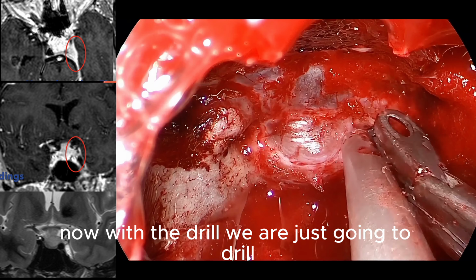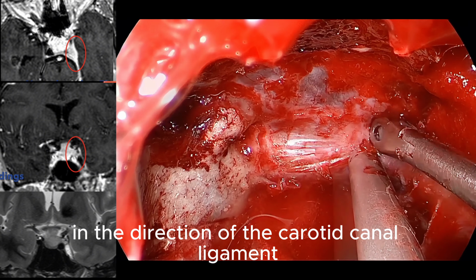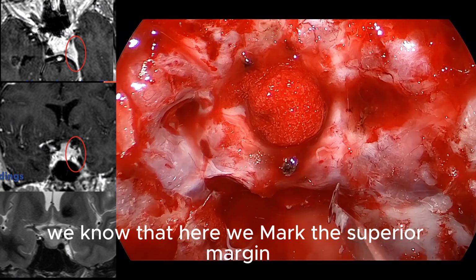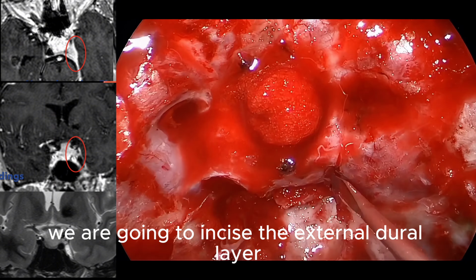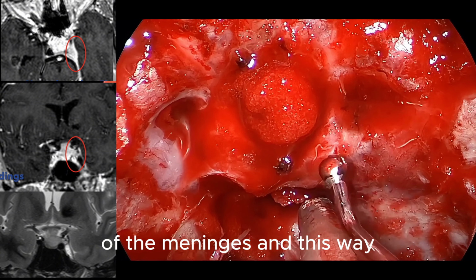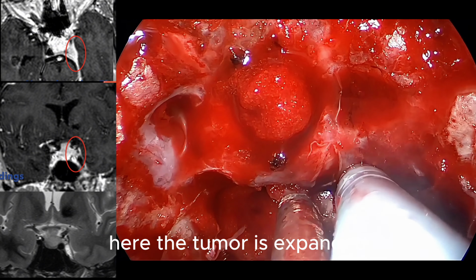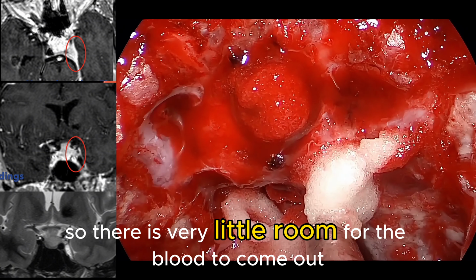Now with the drill, we're just going to drill in the direction of the carotidoclinoid ligament, taking care of the medial clinoid process. By doing it this way, we know that here we mark the superior margin of the cavernous sinus. So we are going to incise the external dural layer of the meninges, and this way we are going to enter the cavernous sinus. Here the tumor has expanded the cavernous sinus itself, so there is very little room for the blood to come out.